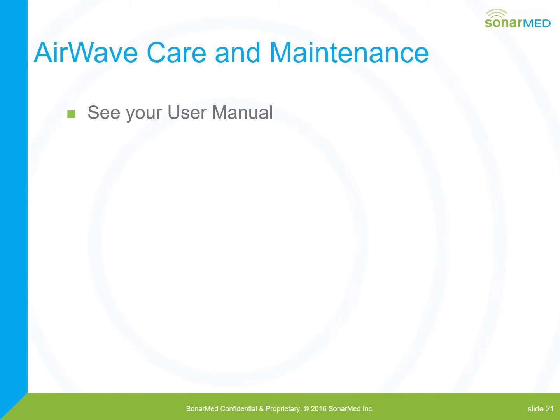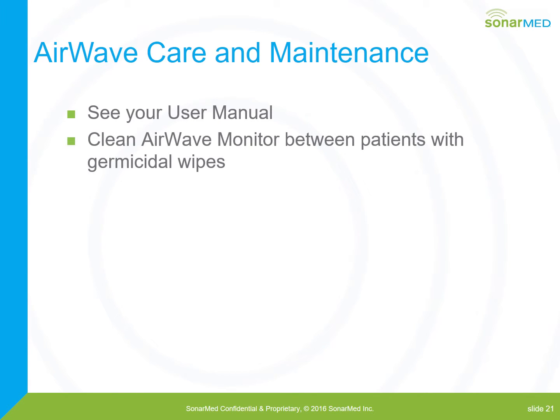So how do we care for the AirWave, and what kind of maintenance do we need? Certainly your user manual has all this information in there. You want to clean the AirWave monitor between patients, and you use the germicide wipes that you have in the hospital for that. Clean the monitor, clean the cable. The cable is reusable. The sensors, however, are single patient use.